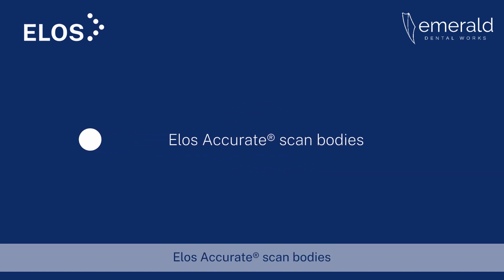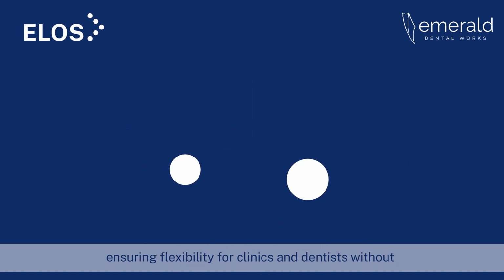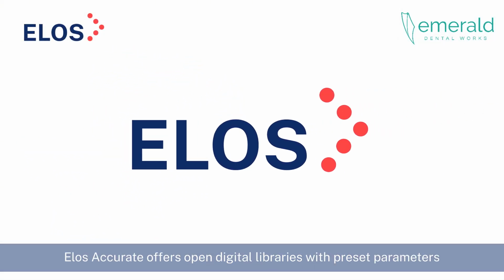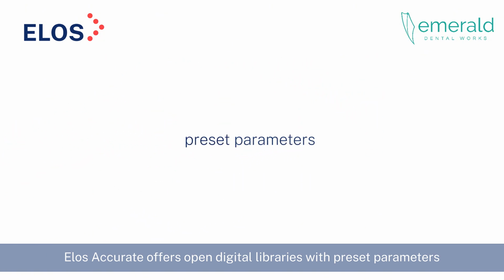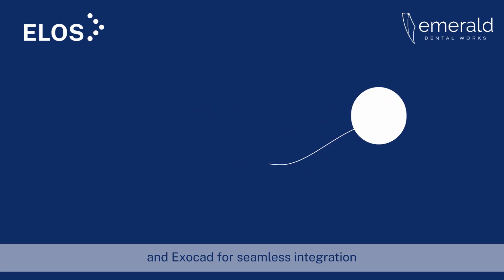Elos Accurate scan bodies provide high accuracy and compatibility with all major platforms, ensuring flexibility for clinics and dentists without being tied to any specific product ecosystem. During the design phase, Elos Accurate offers open digital libraries with preset parameters, fully compatible with leading CAD software like 3Shape and ExoCAD for seamless integration.